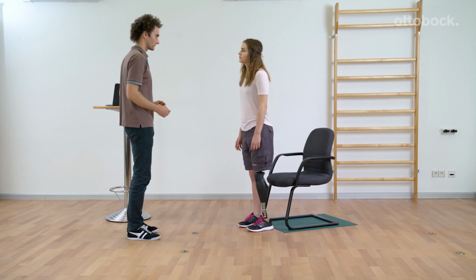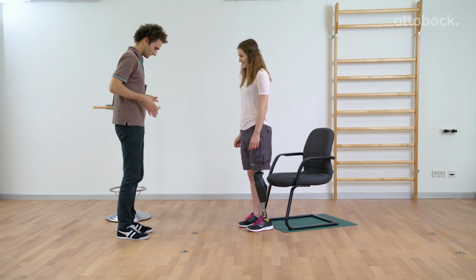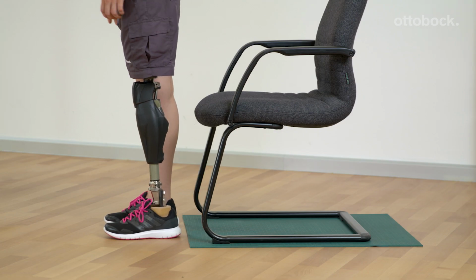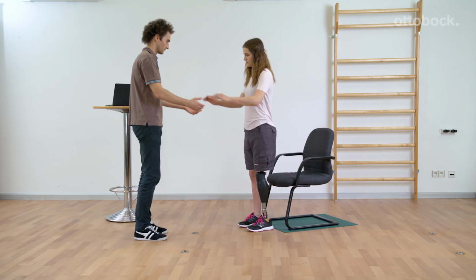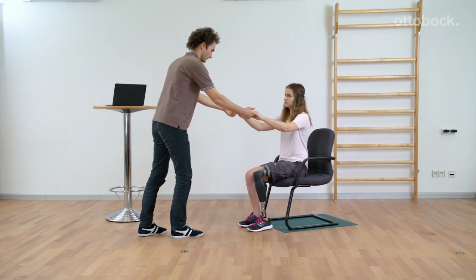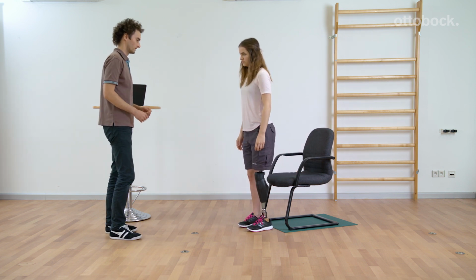First, determine the optimal stance flexion resistance for sitting down. An optimal value allows the user to distribute the weight evenly between both legs. In this case, the recommended value is slightly too low and the user is not sufficiently supported by the knee joint.